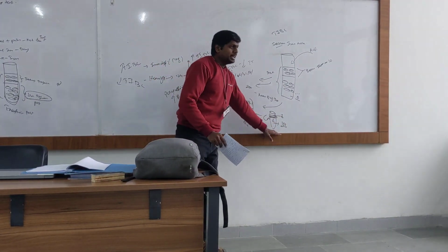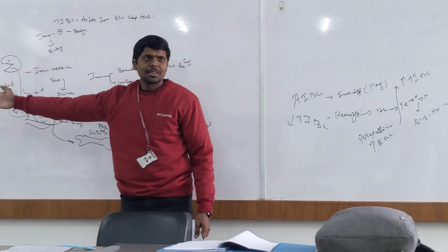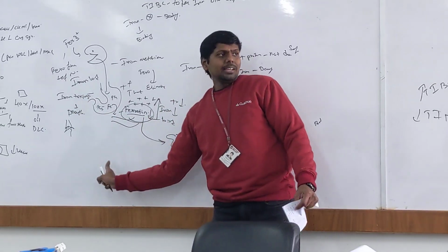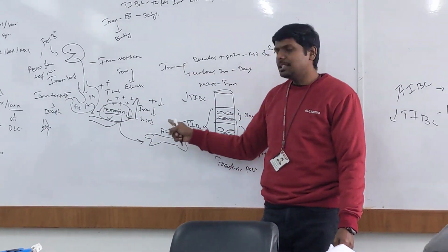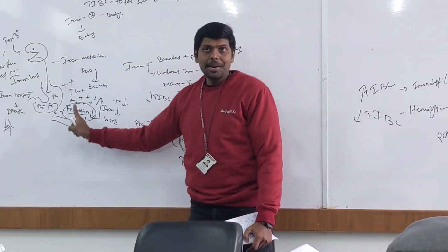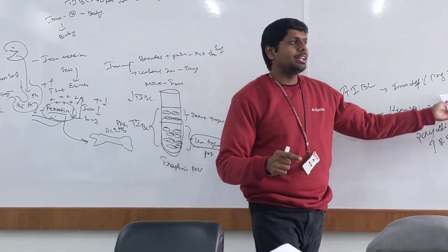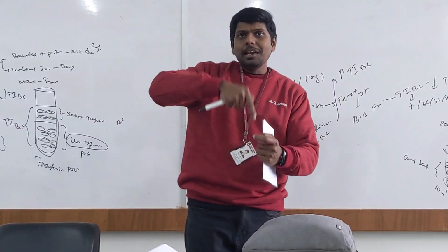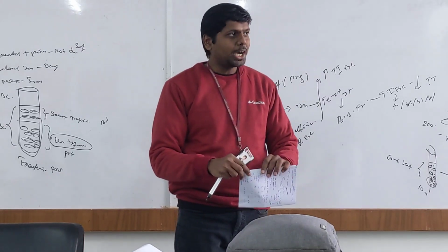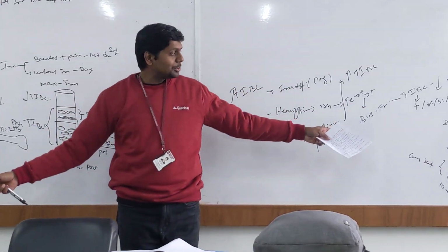Why are we measuring iron binding capacity rather than measuring iron? The reason is, iron is everywhere in the body and iron will cause toxicity. I want to check whether this iron has been properly transferred back into utilization or not. The transfer is done by the transferrin molecule, and I am checking transferrin's iron binding capacity. So this is an indirect test actually. We are using iron molecules to indirectly measure the transferrin levels in the serum. Is the concept clear now? If you follow from A to Z, then you will understand.